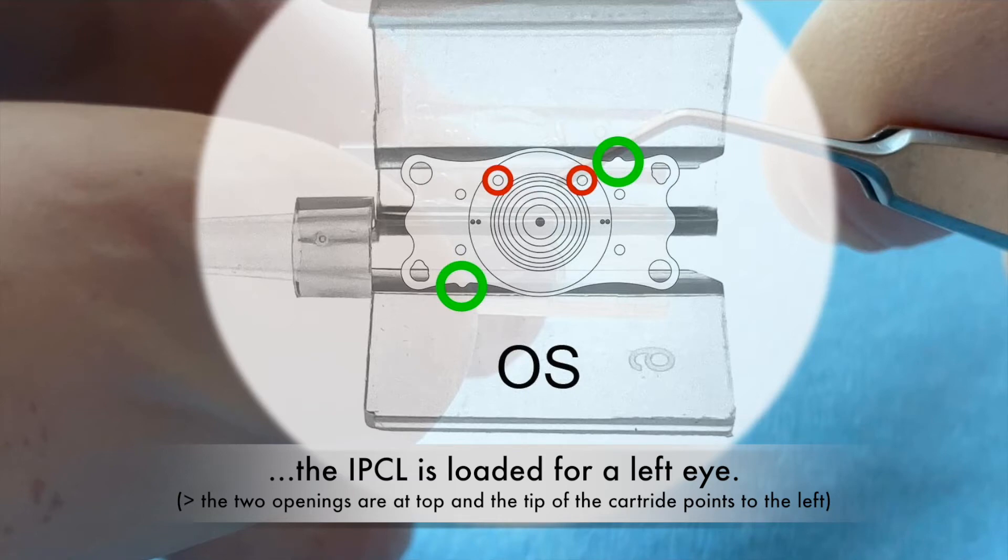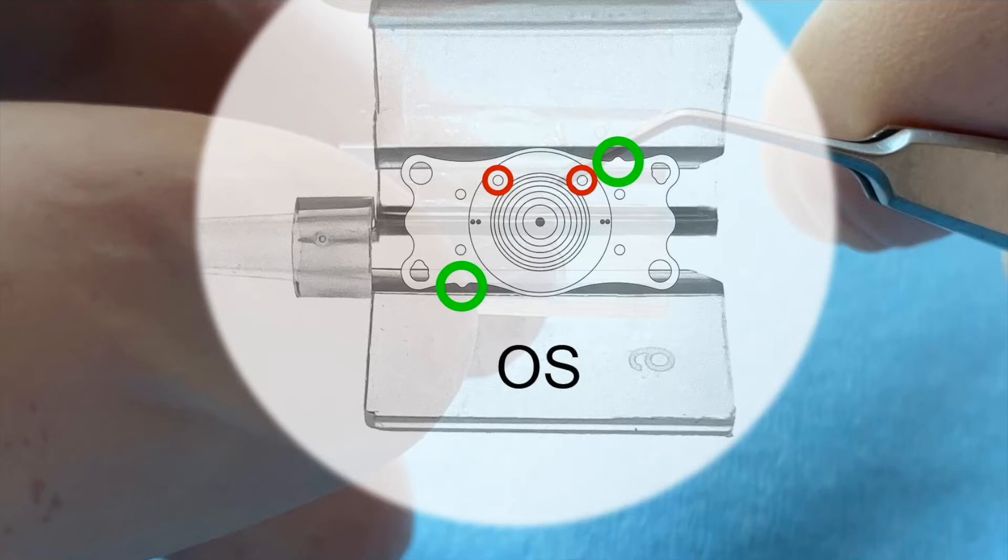For a right eye, the two openings should be at the bottom or the tip should point to the right.